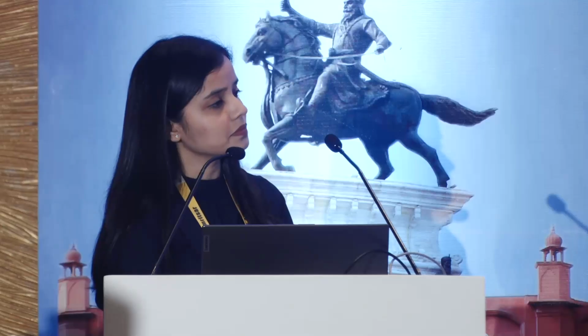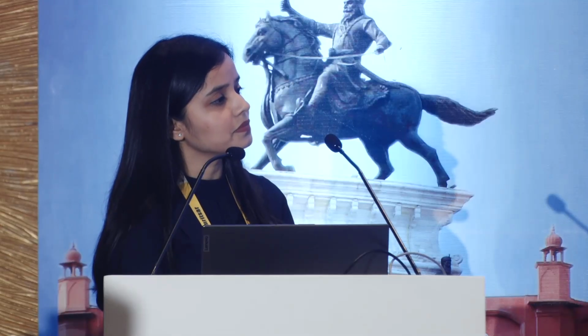So basically, the main cause for decrease in vision in PDR would be vitreous hemorrhage and macular changes. That's all. So there is no confusion in diagnosing that. So why do we need OCTA for that?